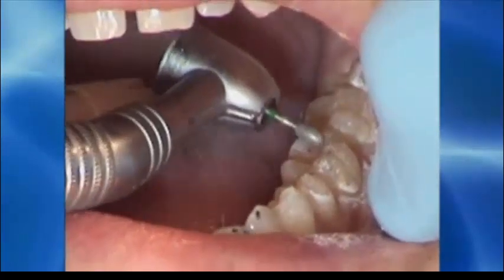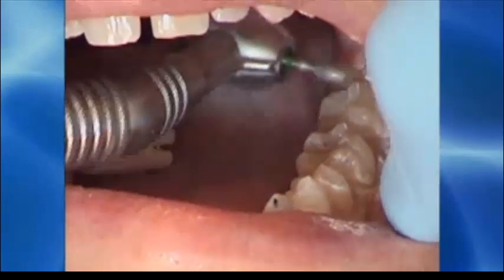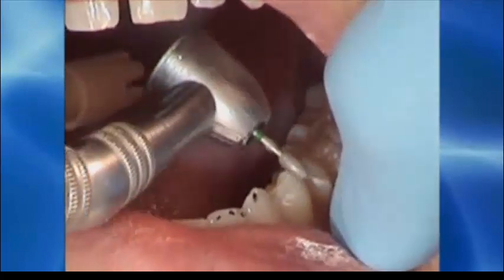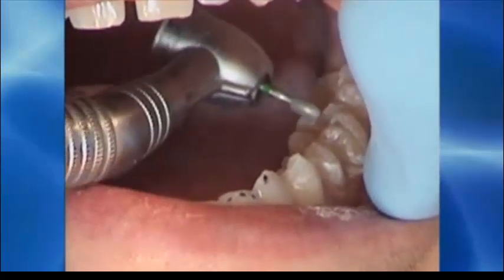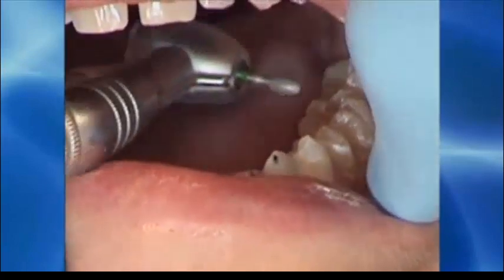Here I am trimming around this central fossa contact on the lower first molar, and also the balancing incline again on the lower second molar, and once again on the buccal aspect of the premolars, trying to bring these contacts to be very small in size with very little inconsistent markings around them, all of those markings being removed.